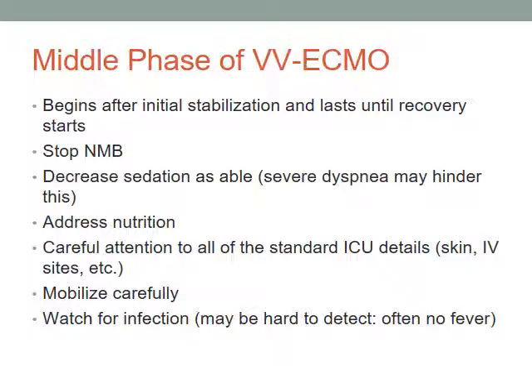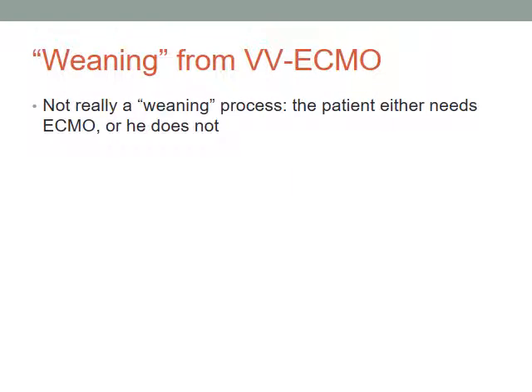And then weaning from ECMO, the last phase, it's not really a weaning process. You either need ECMO or you don't. It's not an issue of, well, we'll have your lungs work a little bit more today, maybe they'll get stronger. No, it doesn't work that way. Either the lungs have recovered or the lungs haven't. It's as simple as that. And we simply have to discover that.